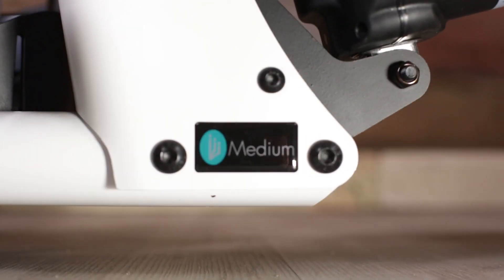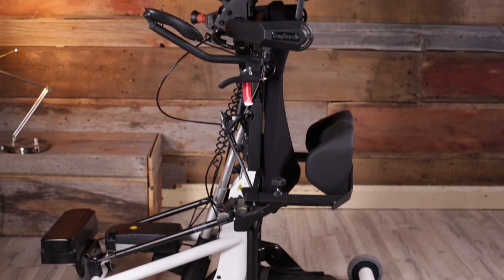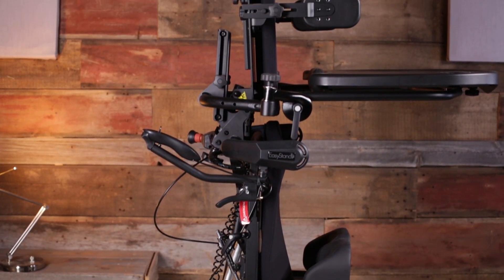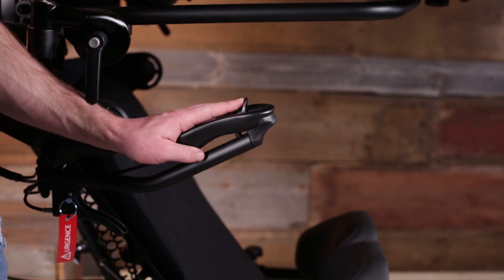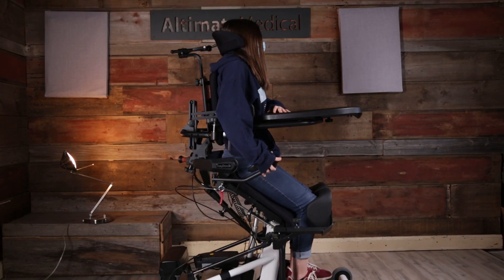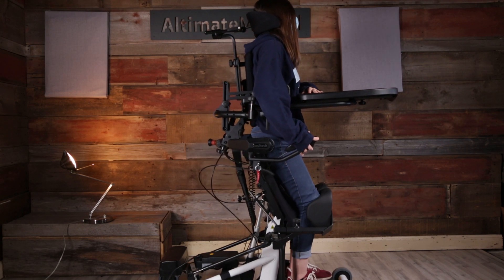The Bantam medium creates positioning opportunities not available with any other standard. A user can go from sitting to standing independently with the power-up option when ordered with supine. Sit to stand is only one of the many position possibilities.